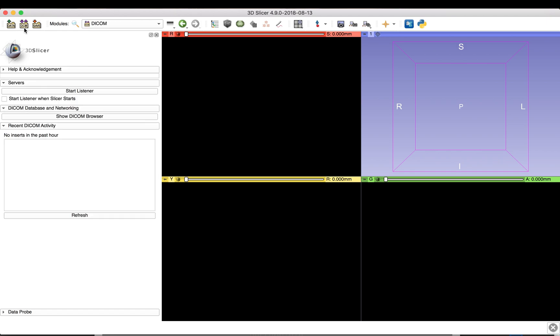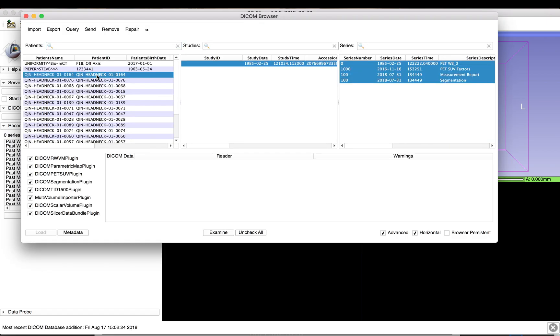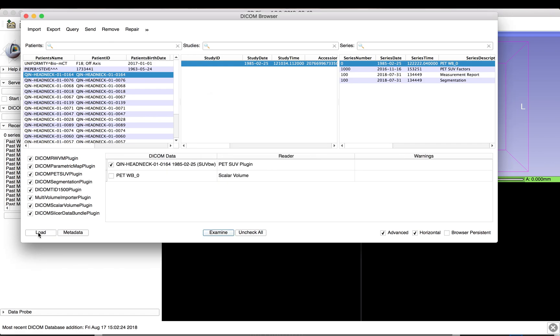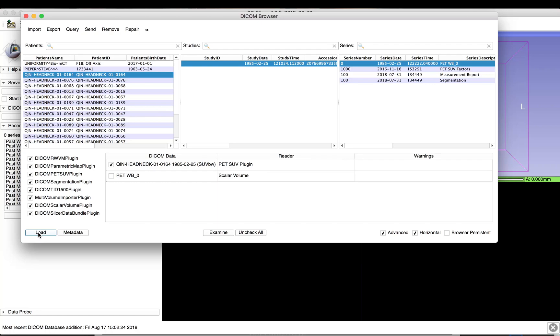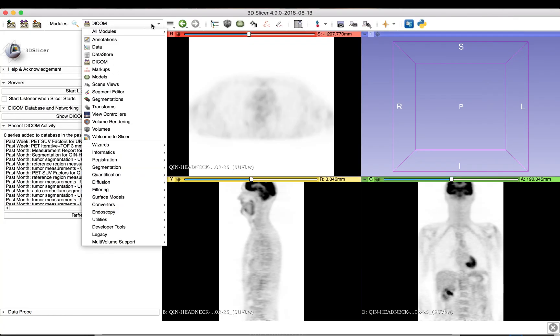Begin by loading the PET scan that you wish to analyze from the DICOM database. In order to load the data set as a SUV normalized volume, make sure that you select the DICOM PET SUV plug-in.